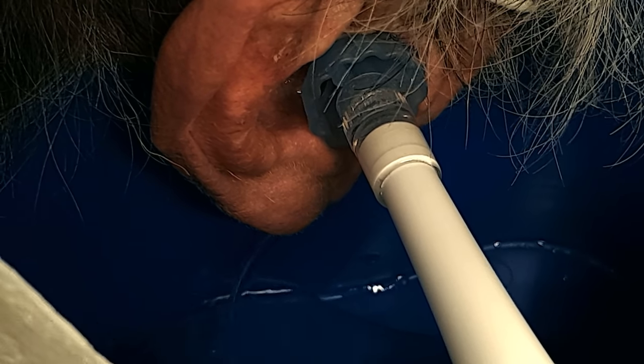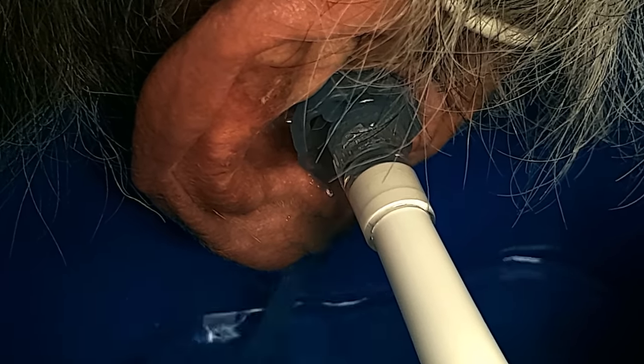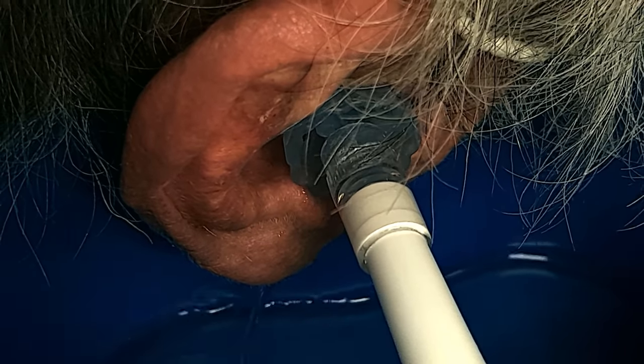They have to be able to sit still. So I'm deferring to irrigation here for a short period. This is nothing high-tech — it's basically like a squirty bottle that I'm putting in his ear with water in it. The blue silicone tip lodged in the ear canal shoots the water out in three directions towards the ear canal walls, so it's not going directly down and smacking against the eardrum, which would be a complete disaster. This just makes the irrigation a lot safer.